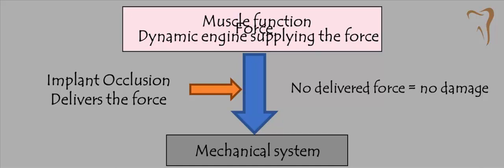And so in this, a dynamic load on a mechanical system is a load that's going onto the system versus a static load, intrinsic to the system itself. An example would be maybe a misfit framework where the screws go down on the framework, and it's a 24/7 internal load. But we're really talking about dynamic load, repetitive loading on the mechanical system.